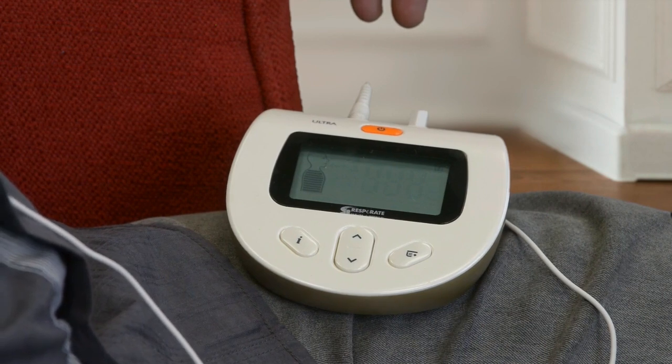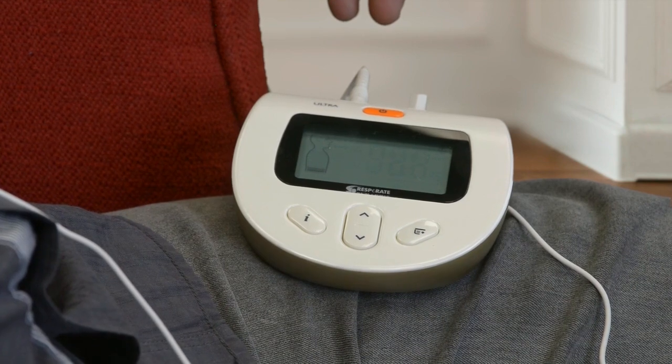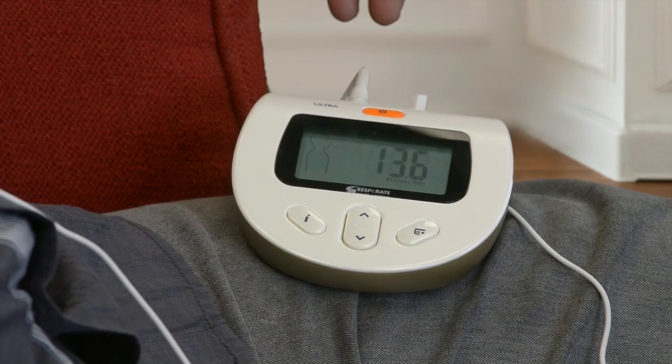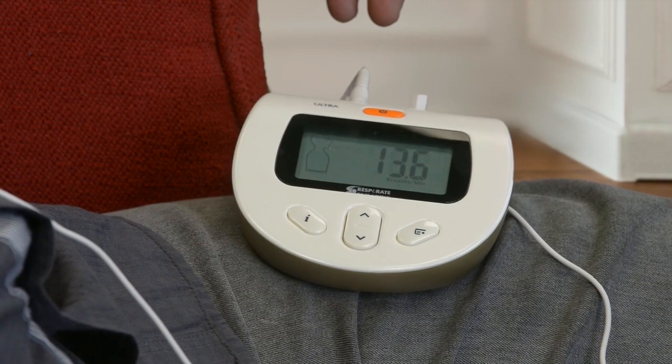Each session begins with a recognition phase. Lean back and relax with the background music, while RESPeRATE gets to know your individual breathing pattern. RESPeRATE has successfully recognized your breathing pattern. Your number of breaths per minute is now displayed, and the figure shows your inhale and exhale movement.